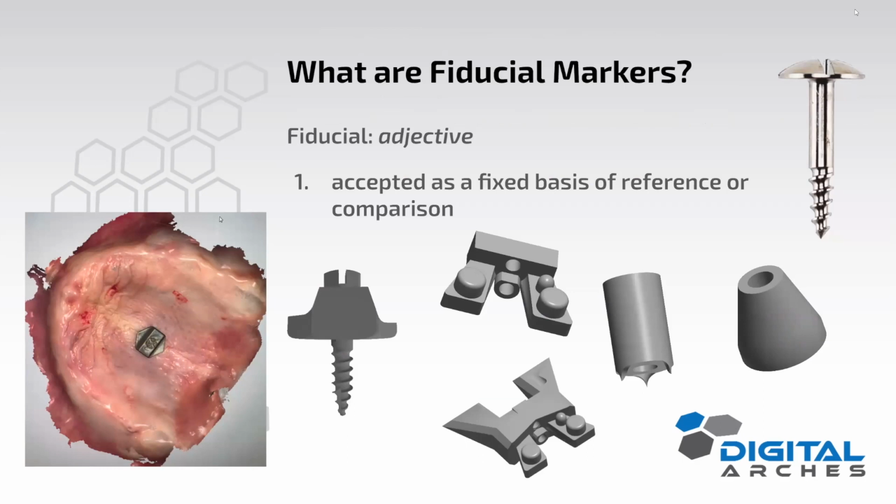And we're actually coming out, we are already selling a pre-release of our version of the fiducial marker, which is the arch tracer, and you see this kind of on the left right here. This is our new product that we are going to be releasing early next year, and it is a directional fiducial marker that you could put in the palate. Oftentimes, you could just use one in the palate, maybe two in the lower, but it really does give you a really nice marker to act as a breadcrumb between different scans, to act as an alignment marker between two scans.